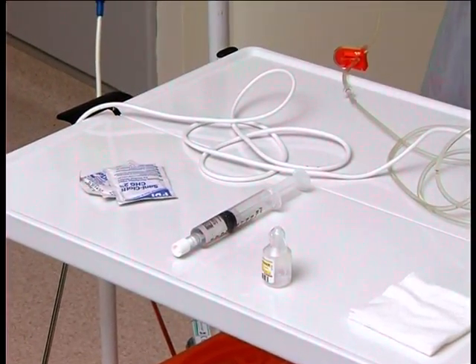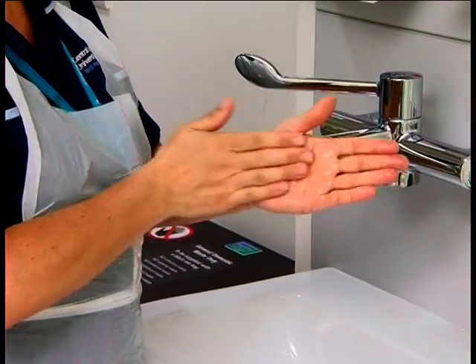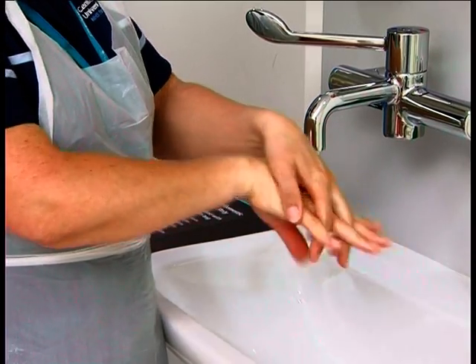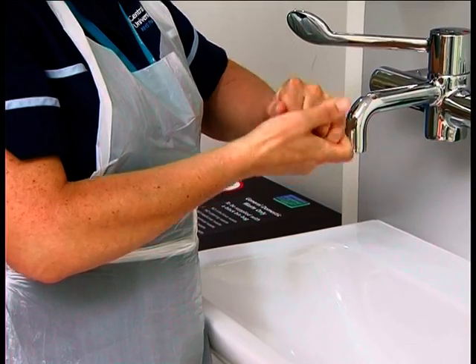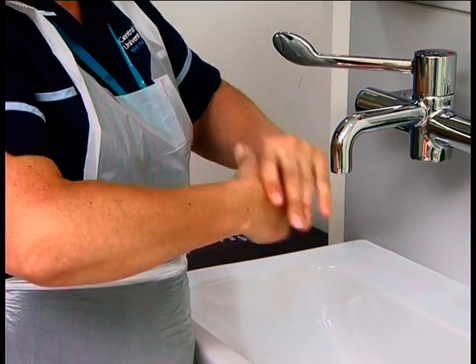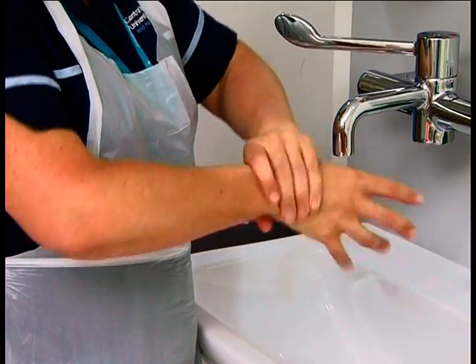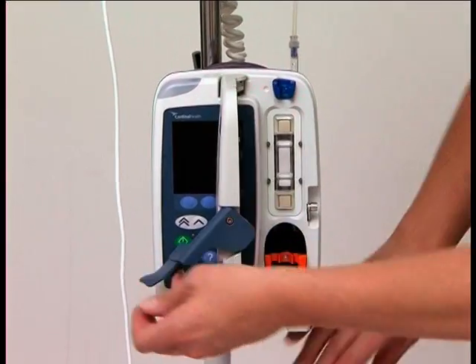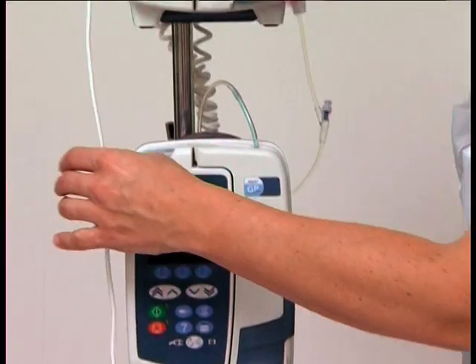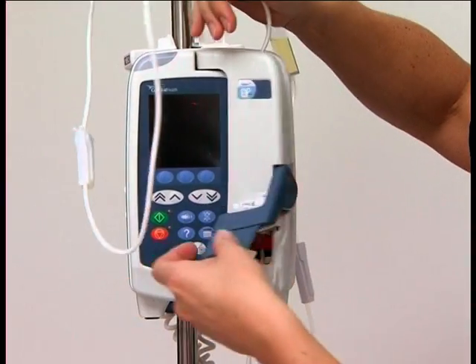Place 2 or 3 CHG wipes on top of the trolley. Remove gloves. Clean your hands with alcohol gel using the same 7-stage technique that you used for washing. Load the infusion sets into the pumps. Position the trolley and equipment near to the child.